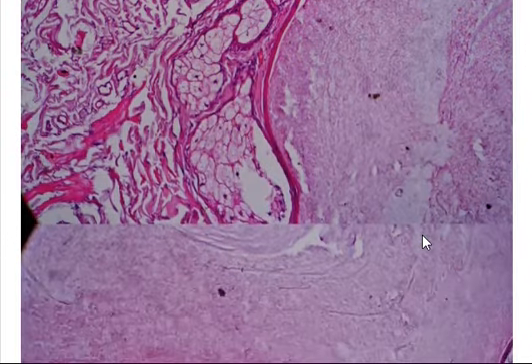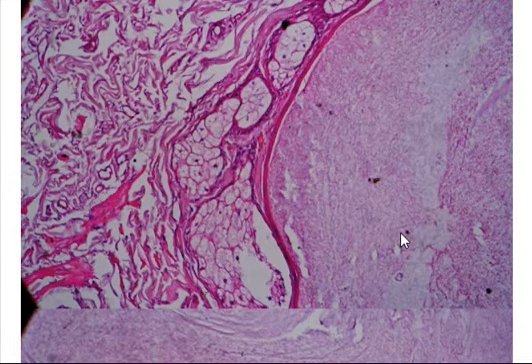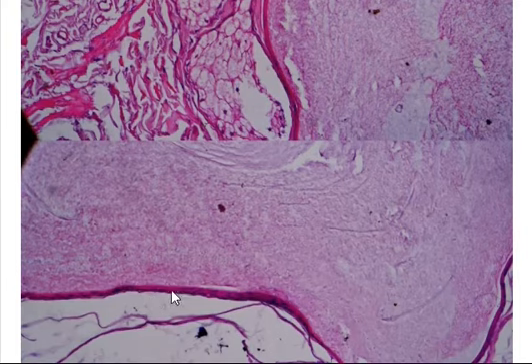But in a steatocystoma, which basically arises from blockage of the sebaceous gland at the duct level, you essentially see the keratin, which is very fine granular, because there's a lot of sebum being produced there, and this is what is called sebolemmal keratinization. There is a thin epidermis, which you can see here.